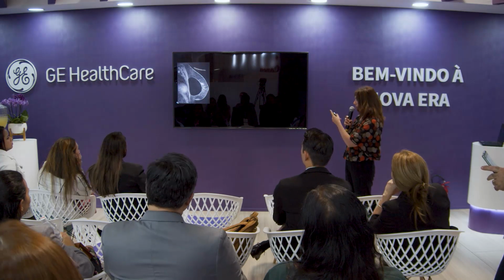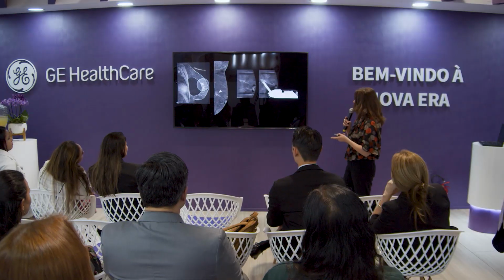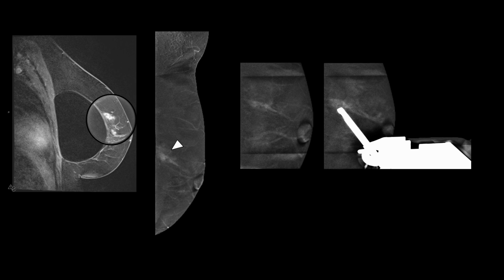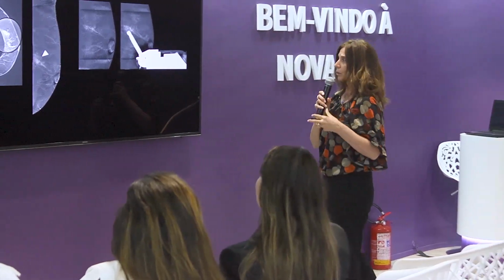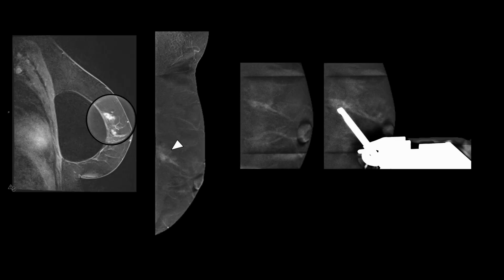MRI lesions detected by MRI, we can now biopsy with contrast-enhanced mammographic guided biopsy. In this case, we elected to do that because of proximity to the implant. With the advantage of contrast-enhanced mammography, we can do implant displaced views. So we did the exam first. I can tell you this was done under a trial, and you could have done the biopsy immediately. You don't need this step. There is nothing to lose, right? So this is now at the time of the biopsy. If we wouldn't have this step, we would see that. So it's not a problem, right? So we know where we're going. And this is just fibrocystic changes and fibrosis.